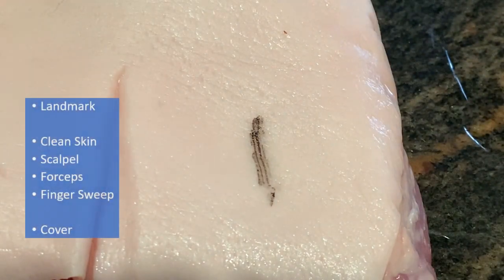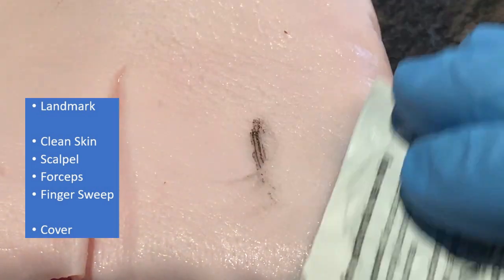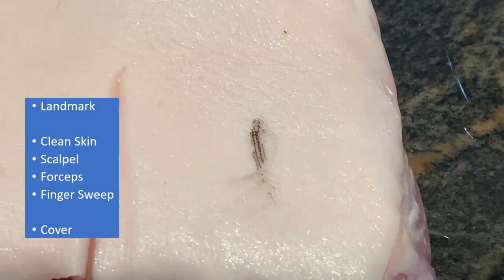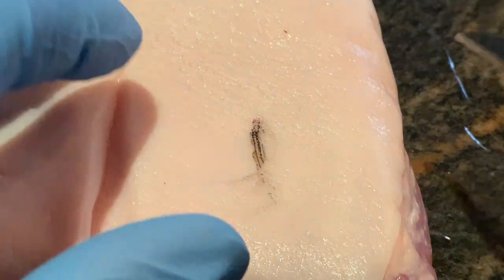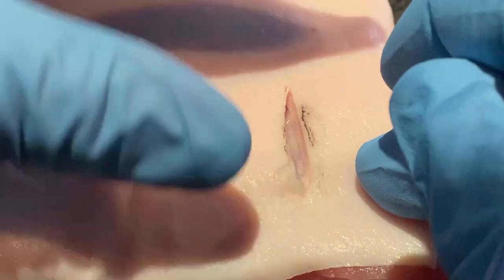We have palpated and we have our landmark marked. We can use our swab to make the area as sterile as possible. We take our scalpel and we are cutting through the skin and subcutaneous layer. Cutting should be parallel with the ribs to expose the intercostal muscles underneath.